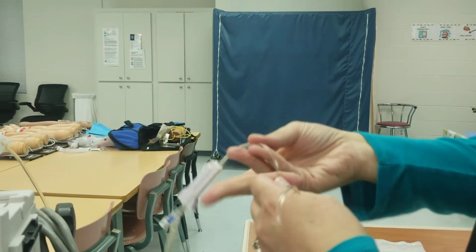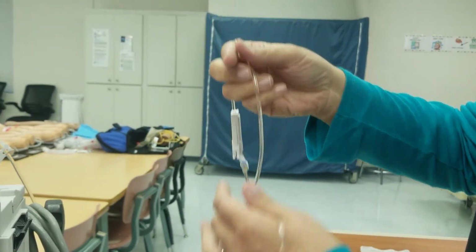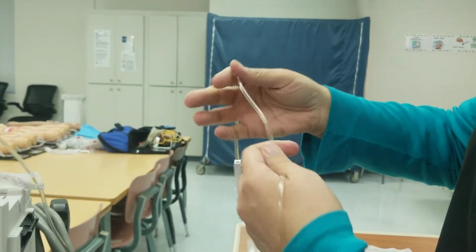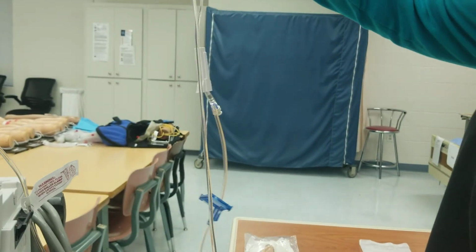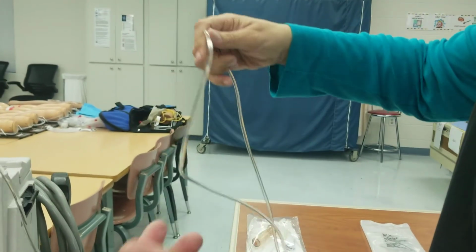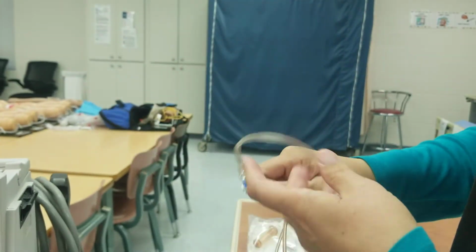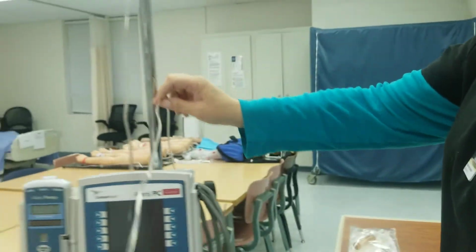So we're just checking our line, making sure that it's primed correctly. We don't want to give them an air bolus that can really harm them, where it's like half your line all air. We don't want to do all that. So those little bubbles are just fine. And we're all the way down to the end. And we've got our cap on. We remain sterile. We're good to go. So there's our primary line.